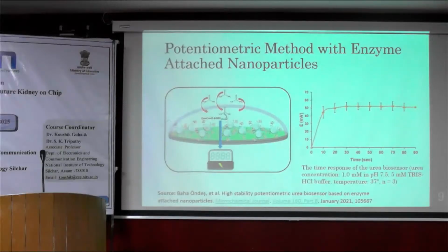So instead of the electrically neutral substrate, we acquire an electrical charge that affects the parameters of the electrode. And if we know how this reaction goes, and we know what potential corresponds to a specific calibrated concentration of urea, that means that we can calibrate this sensor to the urea, and we can monitor this parameter continuously and within some system.